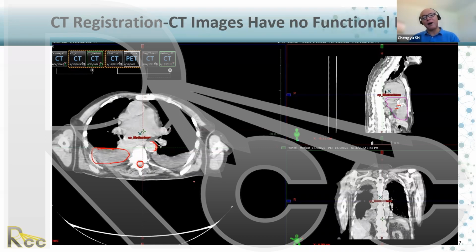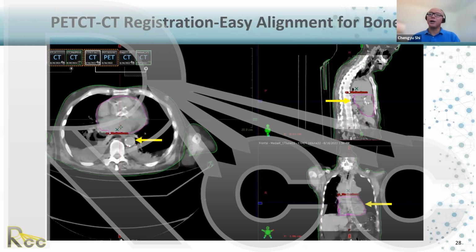On one side you contour the spinal cord. On the other side you contour the spinal cord, and use the contour for registration to help you register it well, right? It's an extra step, but you improve the accuracy. Again, the bone is good, and especially in elderly patients, they have calcium in the blood vessels, and you can use those features to make sure the great blood vessels align. And for the spine, for sure, you can use the mouse or keyboard to fine tune it. And the heart, this one we contour out, and we use the heart for registration, very helpful.